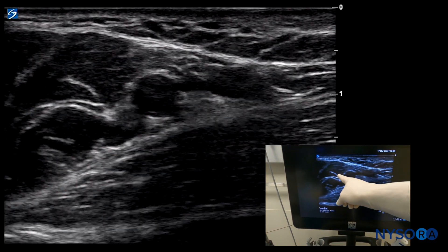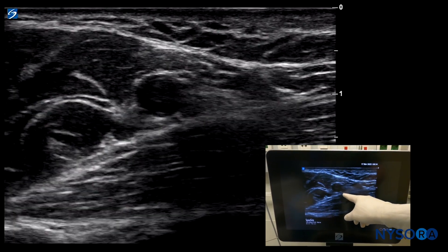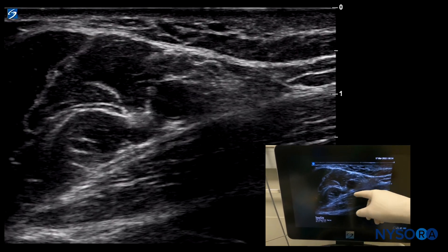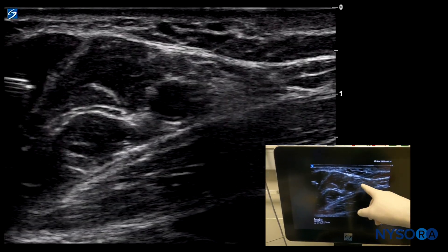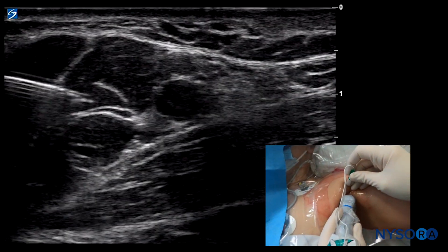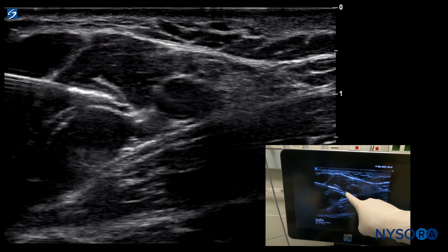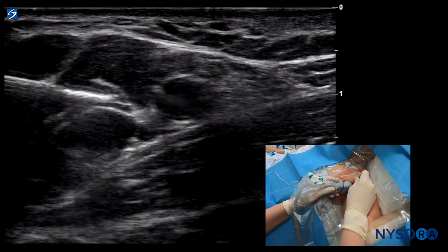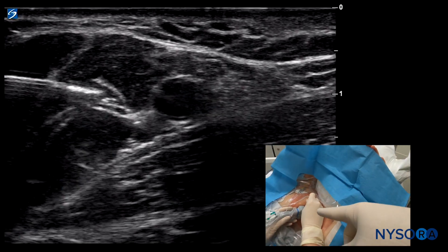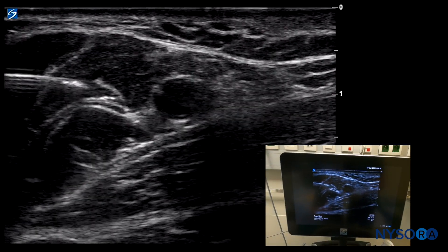We want to pass the needle underneath the axillary artery, in between the two vessels, and then pass it into the sheath — usually accompanied by a perceptible click. We inject eight milliliters of local anesthetic here for the radial nerve. As the needle approaches, we can see pulsations or contractions. The hand is not moving, so that's a local contraction of the biceps — that's the musculocutaneous nerve. If we didn't have that contraction, we could have gone through the nerve without noticing it. This is the value of nerve stimulation.